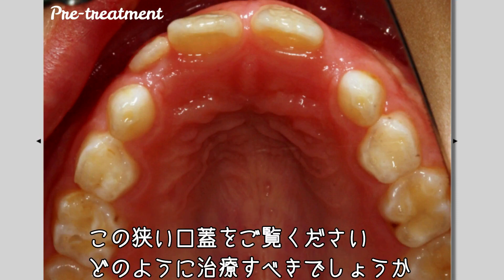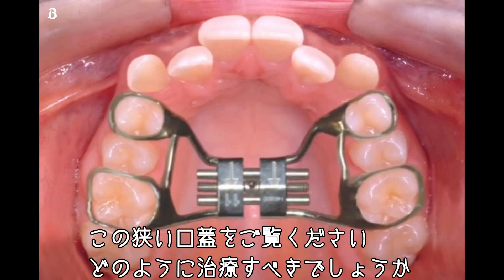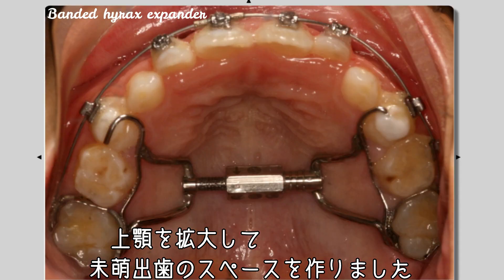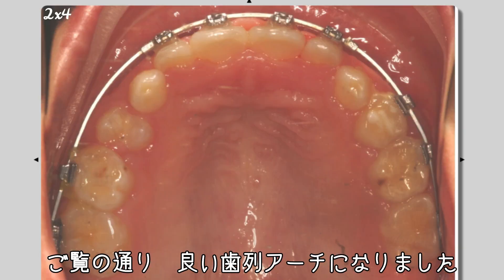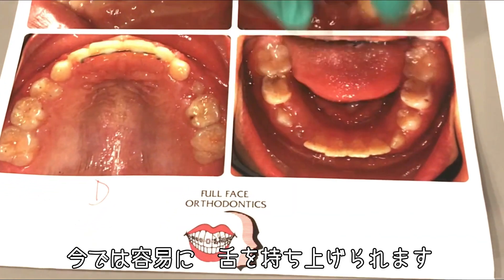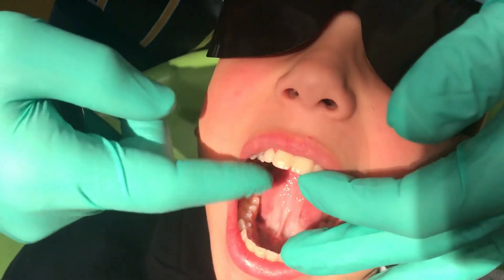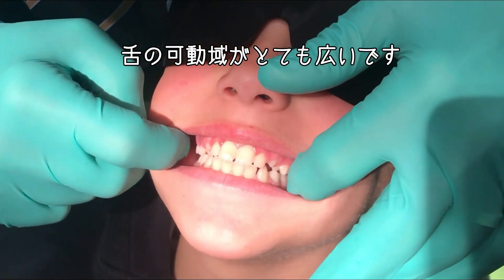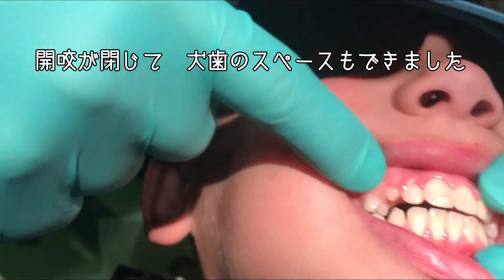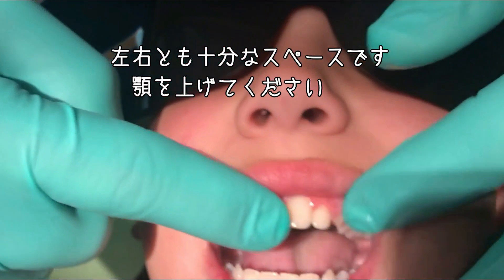And look how narrow the palate is, right? So what do we do for this young man? I widened the upper jaw to make room for the impacted teeth and you can see the nice arch form we've created. We also did a tongue release and I'll show you now how easily he can lift his tongue up. You can see good range of motion. Bite together, close together, and you can see the open bite is closed. Look at the room for the canines — plenty of room here, plenty of room there.